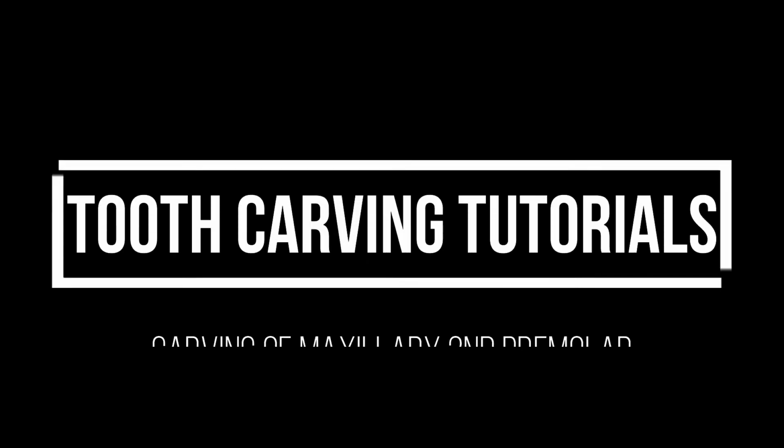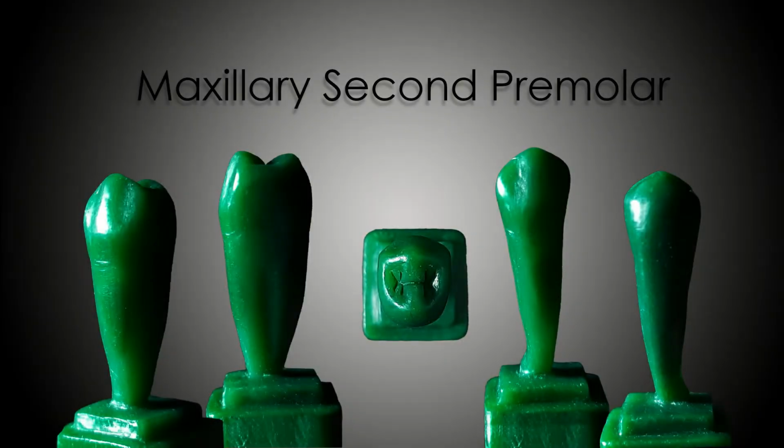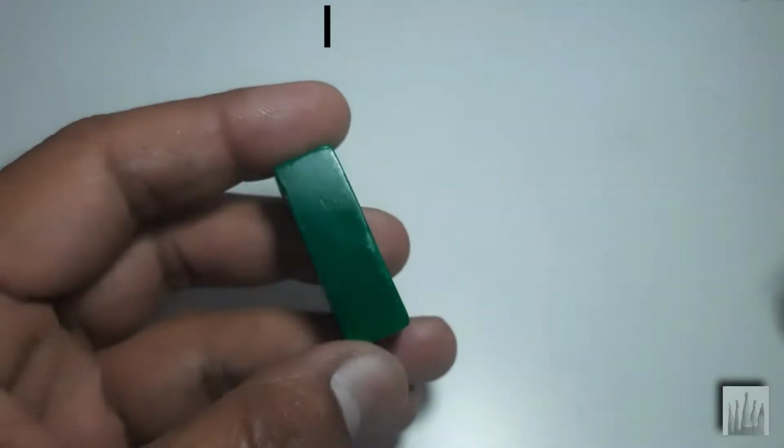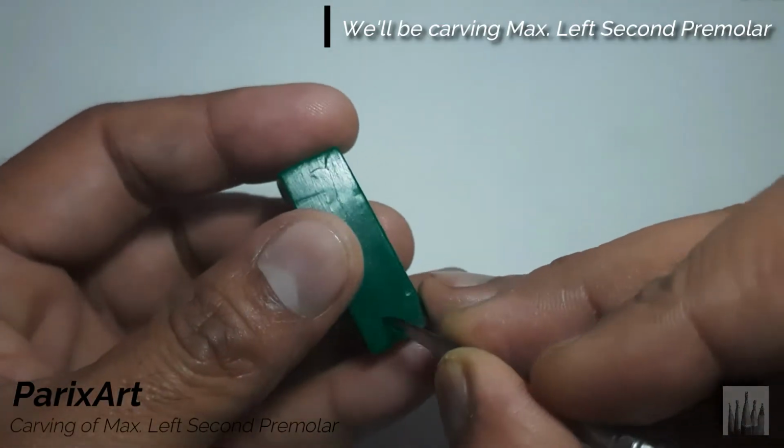Today we'll be learning how to carve a permanent maxillary second premolar. Here you can see its different aspects. It's quite similar to the first premolar, just less angular, more rounded out from all aspects with a single root. So let's start. First we'll mark the aspects of the tooth: buccal, mesial, lingual and distal.